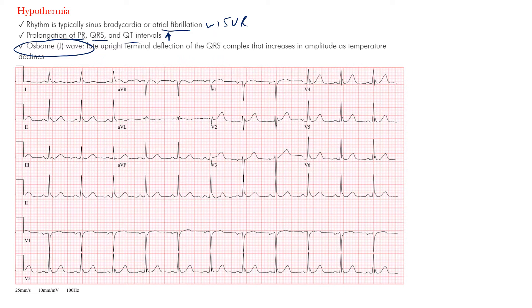You can see the Osborne wave most prominently in V4, V5, and even V6. Notice that tail end occurring at the end of the QRS complex — it's coming at the terminal portion. Remember, delta waves with an accessory pathway come more at the beginning of the QRS. The Osborne or J wave is that positively upright terminal deflection of the QRS complex near the J point in those leads.